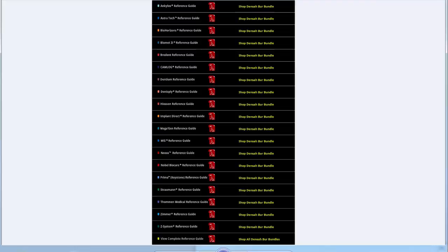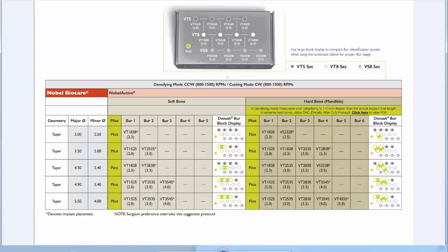The system is designed to be used with any implant system — all the major brands are listed. There's nothing about this drill that requires a specific implant. If you find your brand on their list, you can click on it and it'll give you step-by-step instructions as far as which burr, what order to use it in, and which burrs you actually need for that particular implant and size.